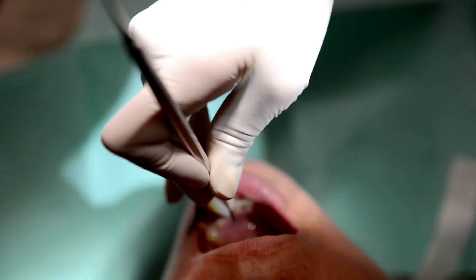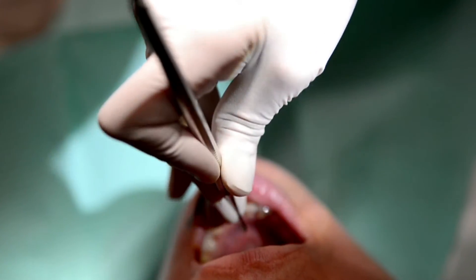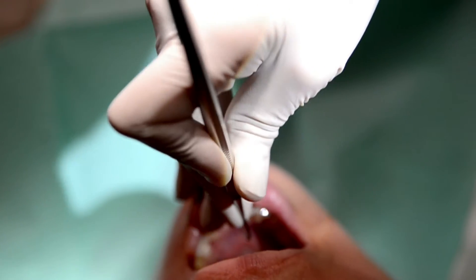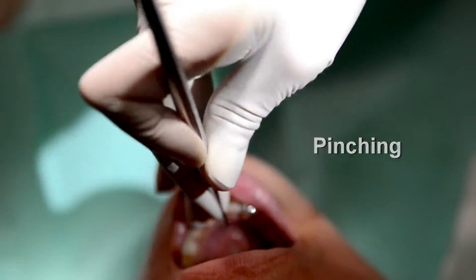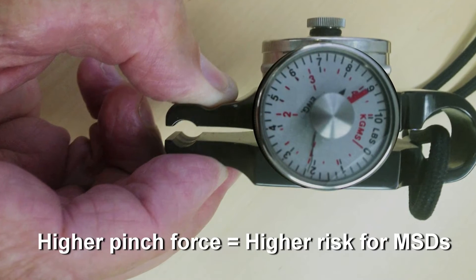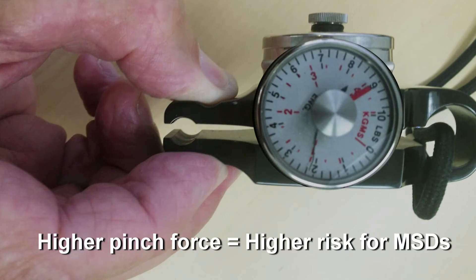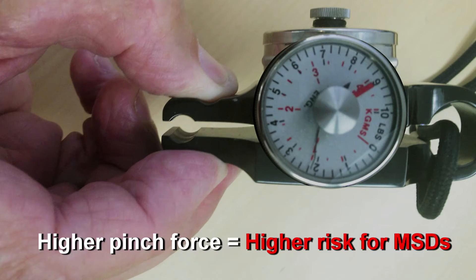Experts agree that the most important factor for getting a musculoskeletal disorder, or MSD, is how hard we pinch our instruments when doing periodontal work. What is called pinch force is the pressure we apply to dental tools when gripping them with our fingertips. Pinch forces are very high when scaling hard-to-remove calculus.